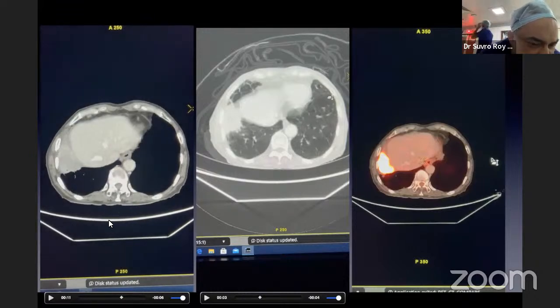Can I convince you that if I window properly, there is a difference between this slightly nodular enhancing margin of the tumor and a little bit of compressed atelectasis? Now, I'm sure when you do the planning, this much of compressed atelectasis you're not going to bother saving. But suppose if it was larger, these are patients that I dug out yesterday when Dipanjan reminded me. So I could have shown you better examples, but I think I can convince you that you can still make the difference between the tumor and the distal very small amount of obstructive atelectasis.